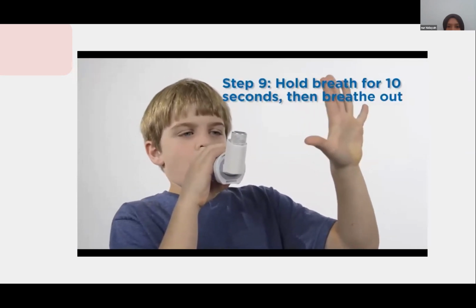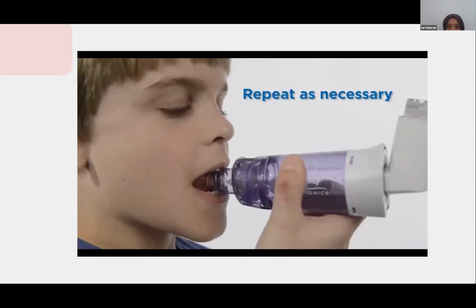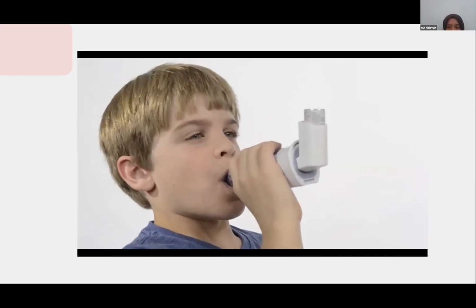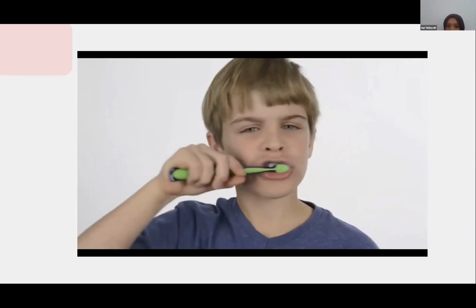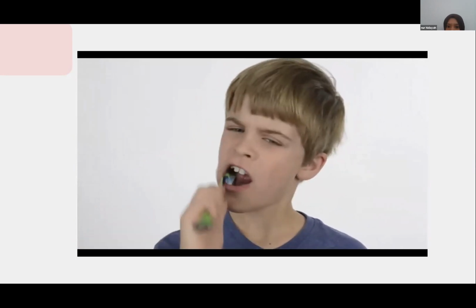Only press 1 time. Wait 1 minute and repeat as prescribed, for a minimum of 2 puffs. If you hear a whistle, you are breathing in too fast. If the medicine is an inhaled steroid, have your child rinse his or her mouth and brush his or her teeth after each treatment. Make sure you rinse and spit and don't swallow.